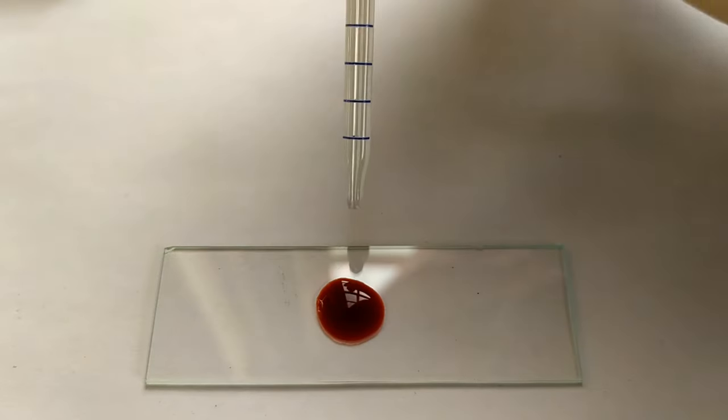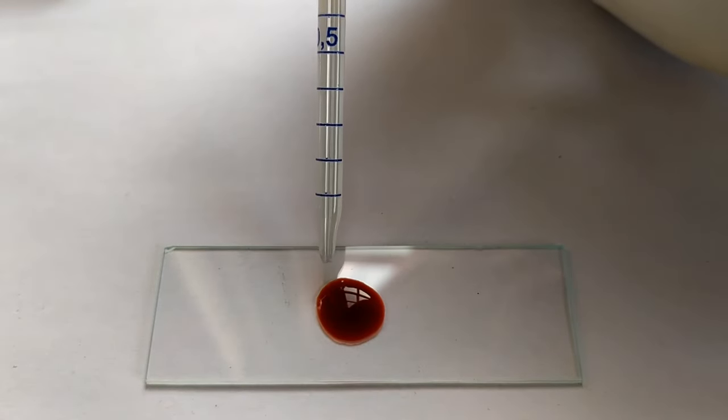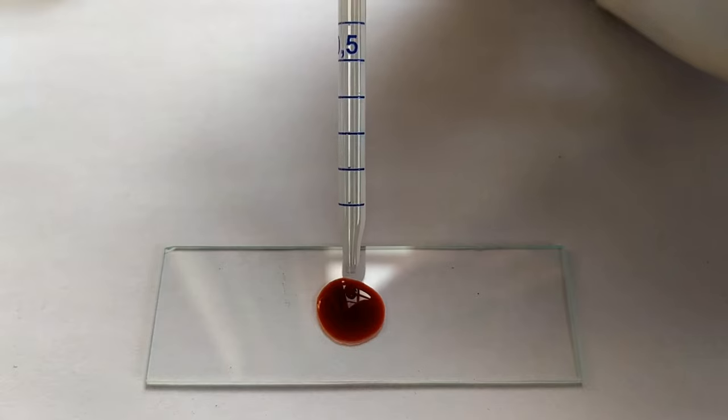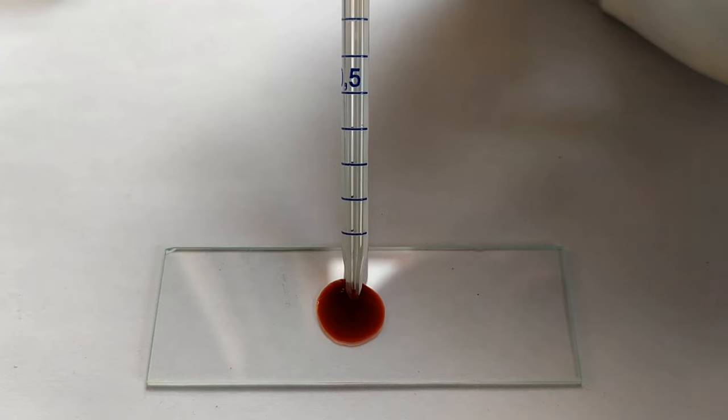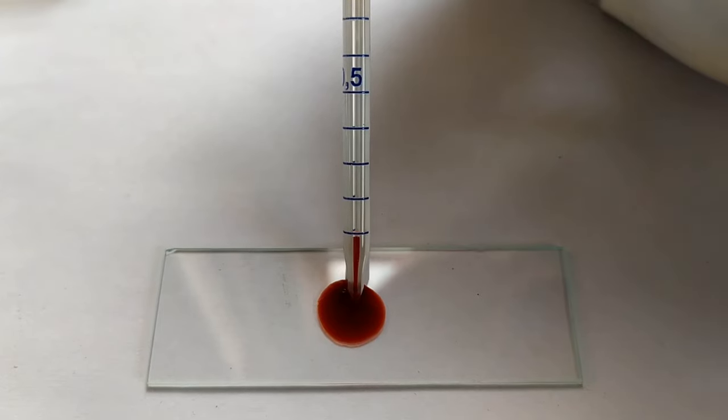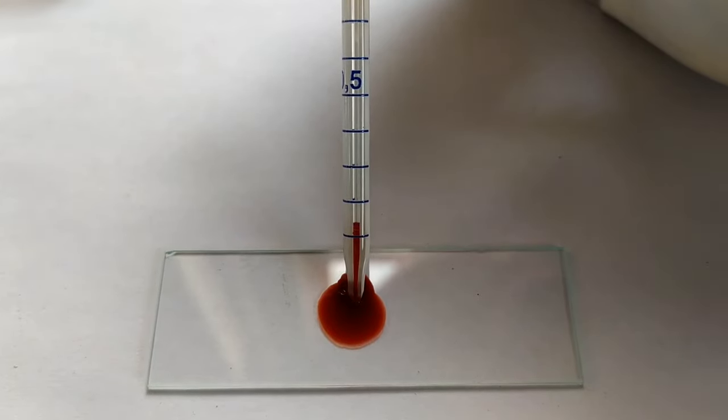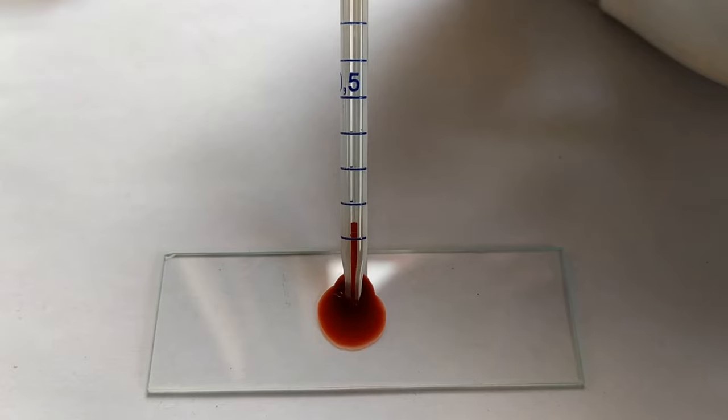Take the WBC pipette pre-cleaned with alcohol. Draw the blood sample till the 0.5 mark using your mouth or a syringe while taking care to avoid any air bubbles from entering the pipette. This step requires a bit of patience and practice.